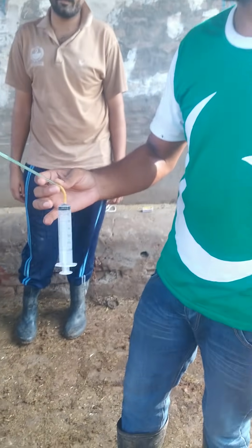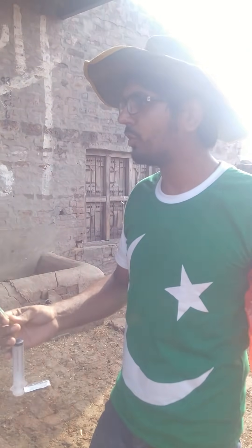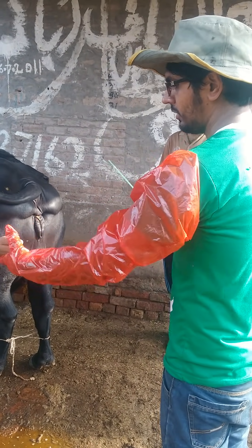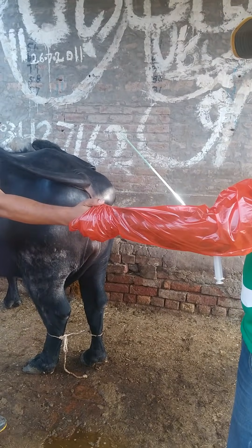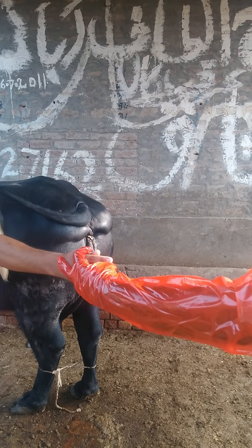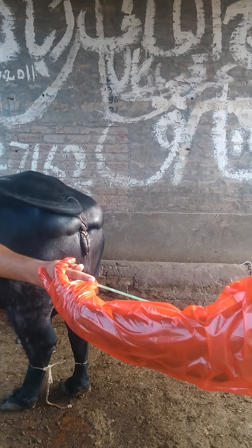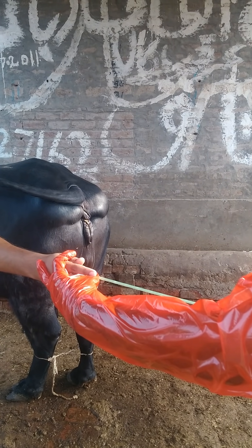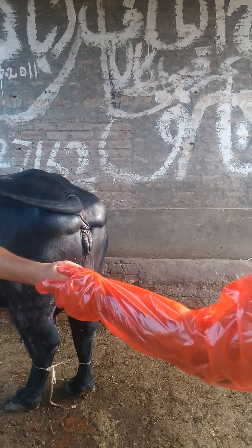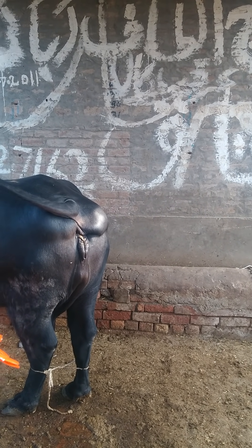The principle is I will move this rod deep into the uterus, into the horns. The first important step when you are going for the passing of the rod is you hold the uterus this way and put your thumb in front of the cervix. When you insert the rod deep into the vagina, I will touch the rod with my thumb — my thumb is just in front of the cervix. I will move my thumb backwards and the rod will go into the uterus, and then with a slight manipulation it will go deep into the horn.